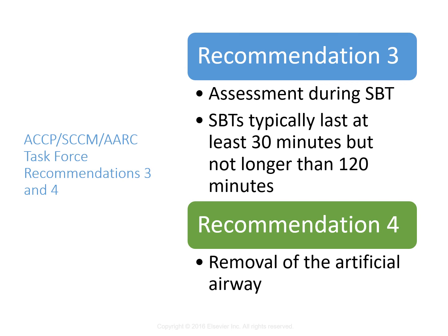So what's their respiratory pattern when you switched them over? How well did their gas exchange? Did their end-tidal CO2 go up? Did their saturation go down? Did their blood pressure change? Did they look more comfortable? Did they look uncomfortable? Patients that tolerate a spontaneous breathing trial of usually 30 minutes, up to 120 minutes in some situations, usually are considered for vent discontinuation.